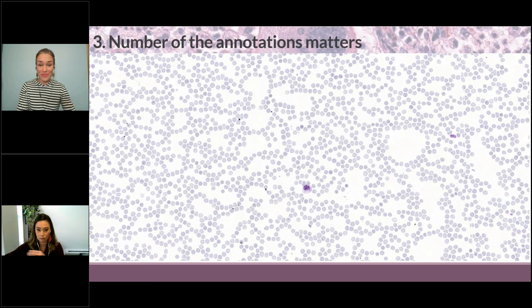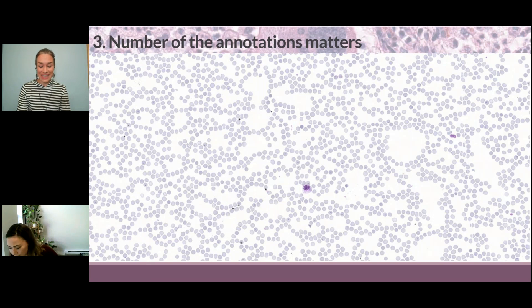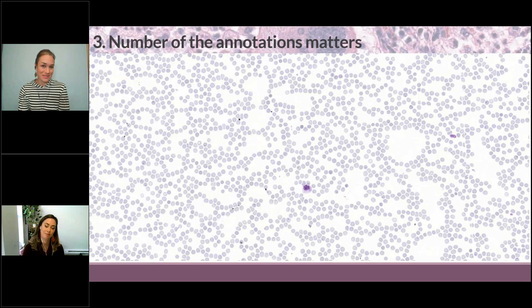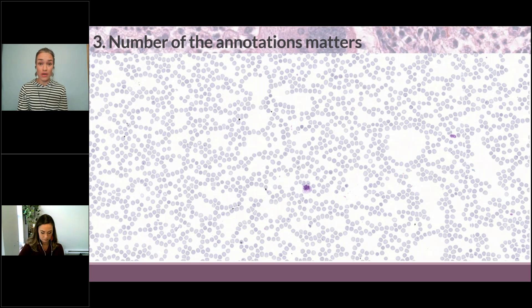But now let's dive into why the number of annotations matters and how to avoid the trap of class imbalance in medical datasets. So at the beginning of my annotation career for deep learning, I would go in and look at the slide and just annotate whatever I saw in the slide in the proportions I saw in the slide.